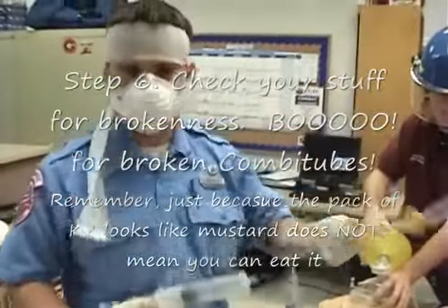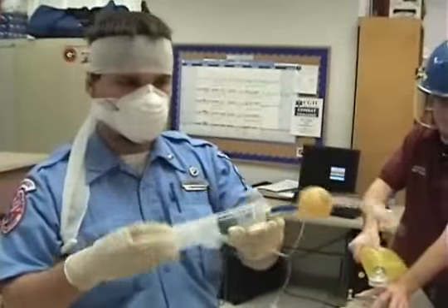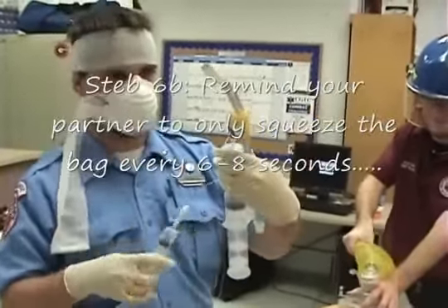And then what we need to do is check and prepare our equipment. Put some air into the big one, make sure it's not popped. Put some air in the little one, make sure it's not popped.